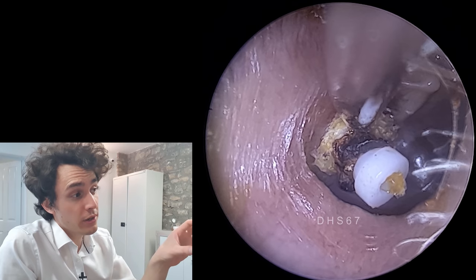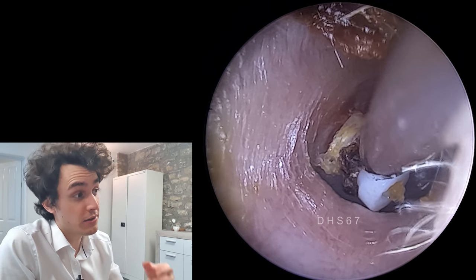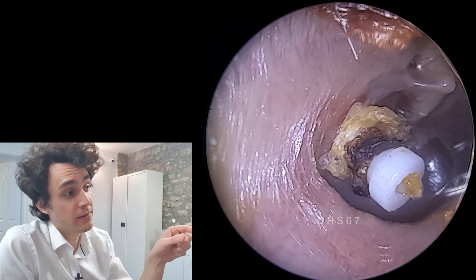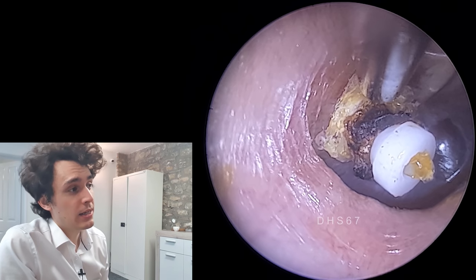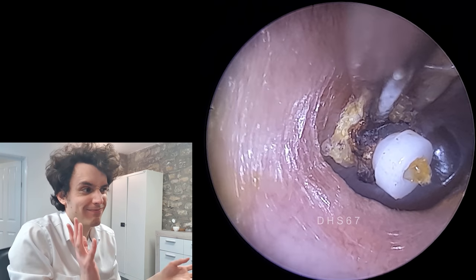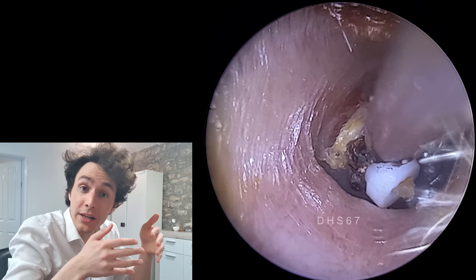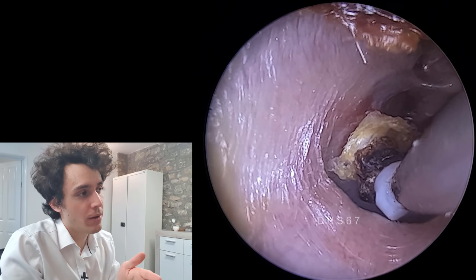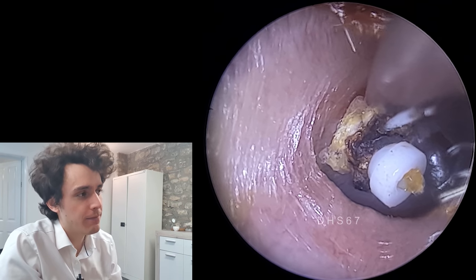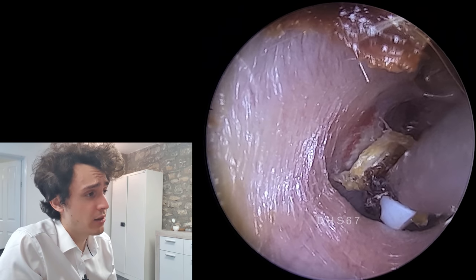It's been extruded because this is actually a Shah grommet. Grommets come in different shapes and sizes, and this is a Shah one — you'll see in a moment that the back end of the grommet has kind of a baffle on it. They tend to fall out at about eight, nine, ten months, roughly. So this one has been naturally extruded and it's now adhered to the left side of the drum. You can see I'm just peeling away here with the suction, and unfortunately it does cause a little bit of bleeding, but it couldn't be helped.